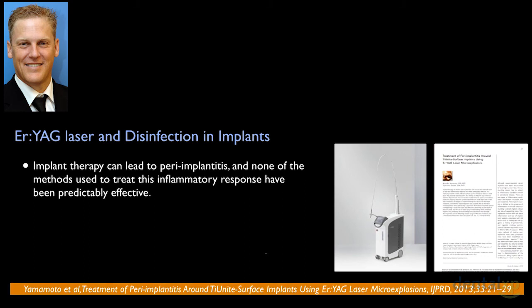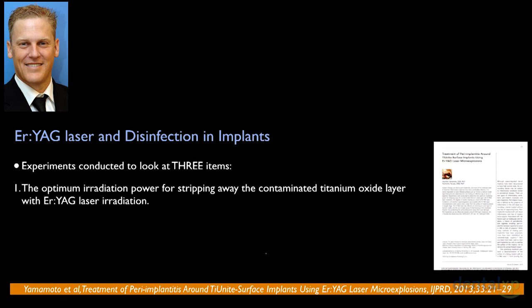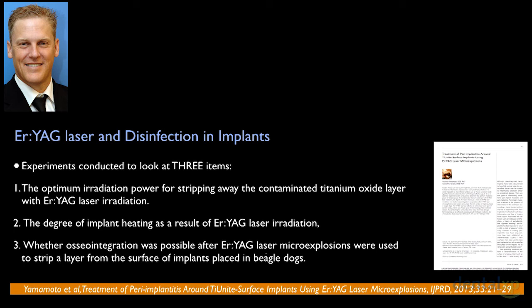There's been 3 excellent studies in the last 2 years done in IJPRD looking at the role of erbium lasers to predictably disinfect implants. This Japanese group in their first study looked at whether TiUnite surface could be removed completely by an erbium YAG laser. They looked at 3 critical criteria. The first being, was there an optimum power density that could be used to remove the TiUnite surface? Did it overheat the implant? And finally, were the microexplosions that were present from the erbium laser cleaning the surface enough to allow reosseointegration to occur?